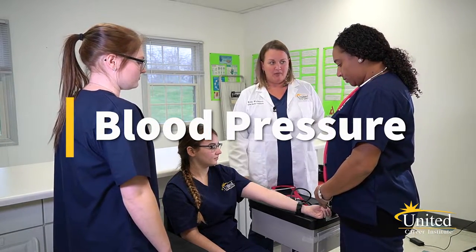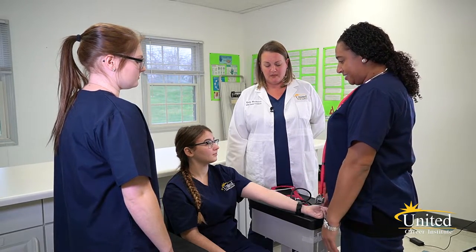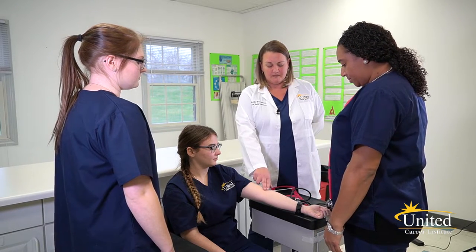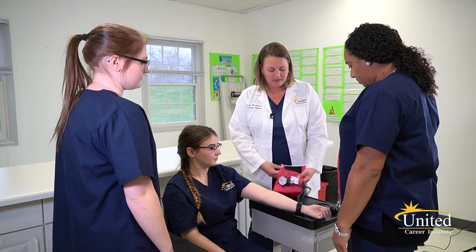First, you want to palpate for the brachial artery. How would you locate that? On the pinky side. Okay, so find it.